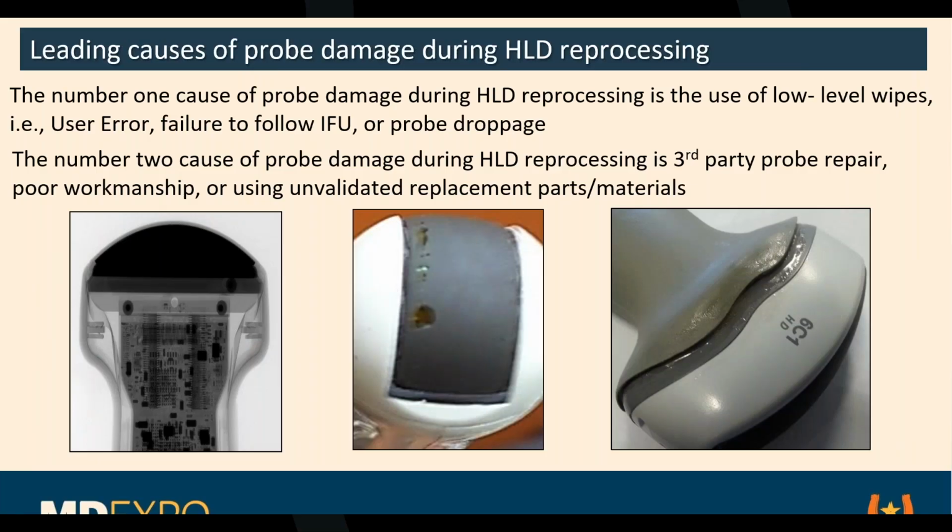transducer in the middle is a GE probe. It's an endocavitary probe. Sometimes the sonographers will take that wipe and just, like they're buffing shoes, wear down the thickness of the lens, and that can cause tears in it. When the lens is worn thin and then you put it into a hostile chemical environment, it breaks, it bubbles open. We have objective evidence of that as well.